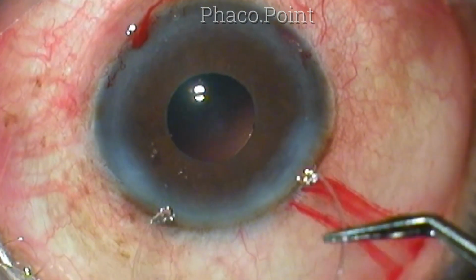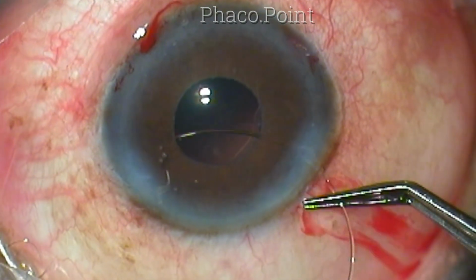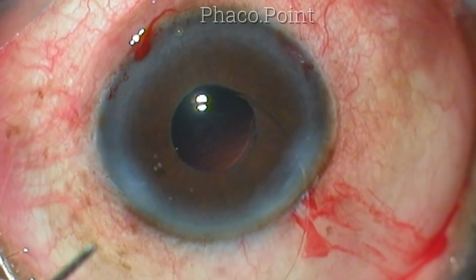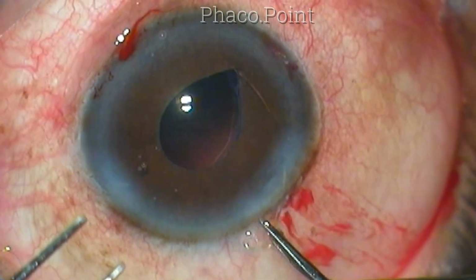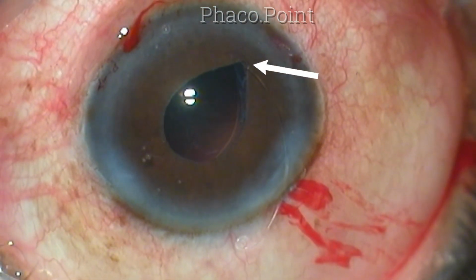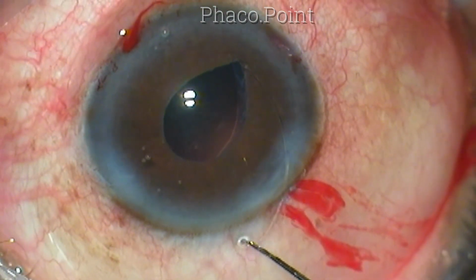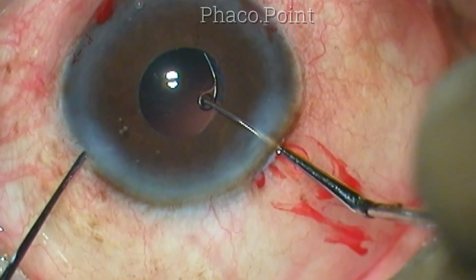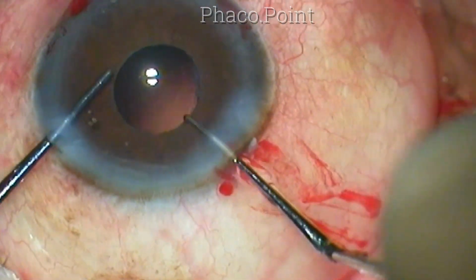So the first loop is fed into the capsular bag, and then it is slowly threaded into the capsular bag. Normally, the flexed portion of the capsule tension ring should be supported with a second instrument, but however, because the pupil is small, the pupil itself is supporting the capsule tension ring, and this will not cause an abnormal stretch of the capsule, and hence I do not try to support it. So finally, the trailing loop is then also implanted into the capsular bag.